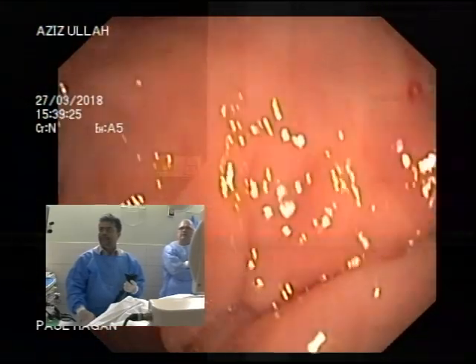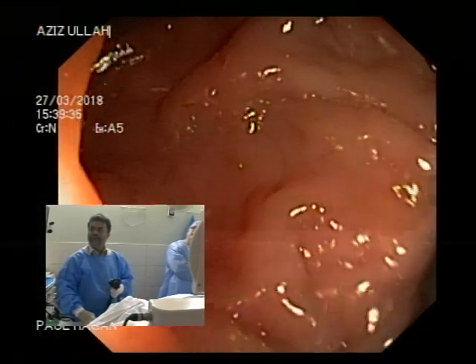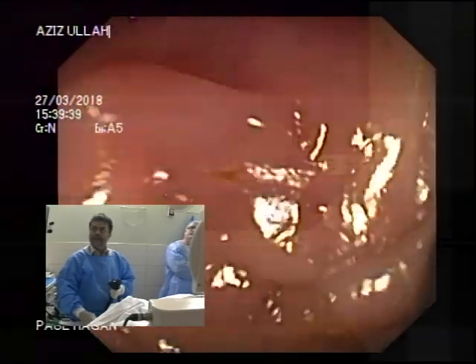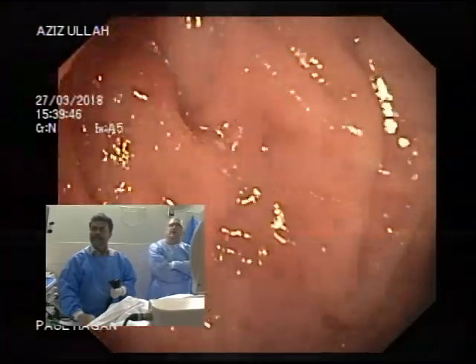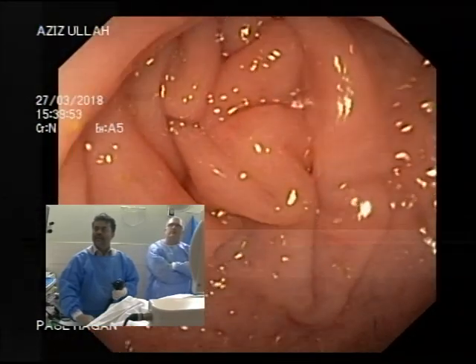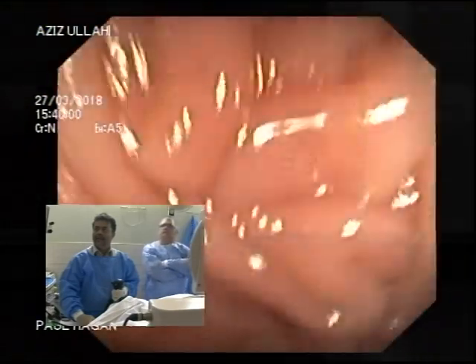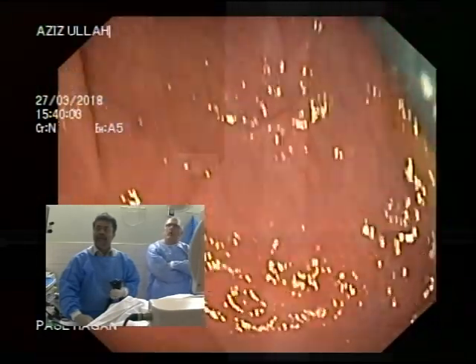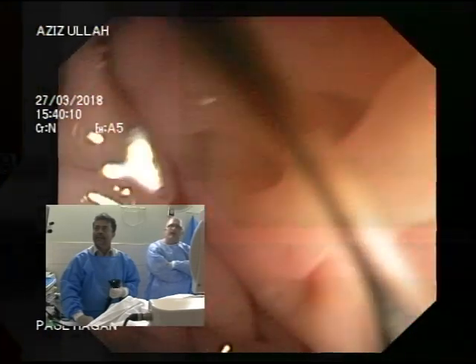Oh, aphthous ulcers. Now those type of ulcers, what do you think they could be caused by? Is it inflammatory bowel disease? There is a small chance. What else could be causing them? Bowel prep. Okay. Aphthous ulcers are not uncommon with phosphate soda preps, which is what you use, a phosphate soda based prep.